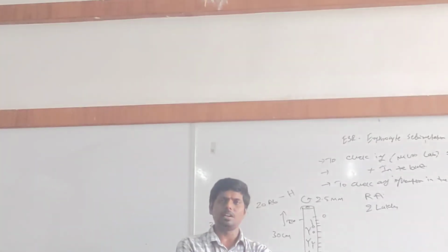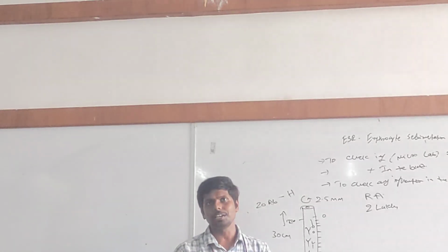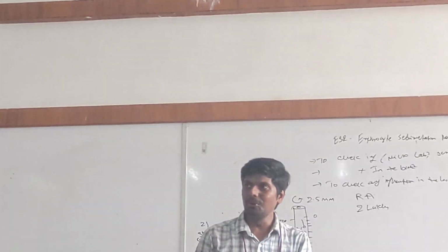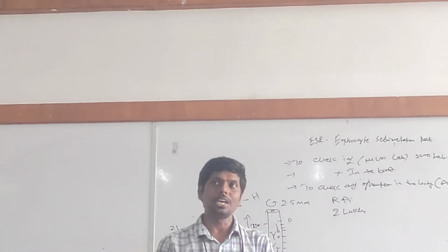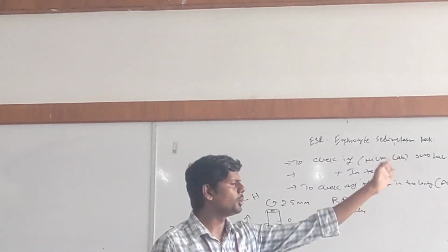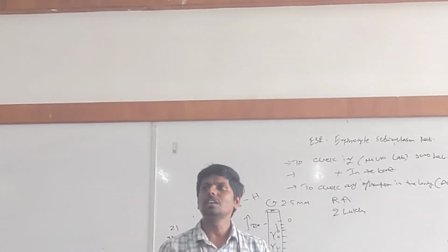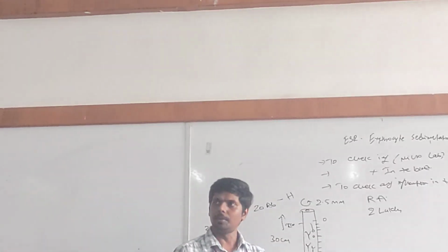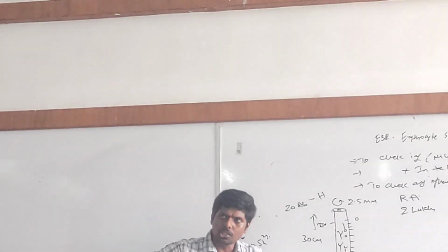I just need some amount of your blood. I will keep it in a vertical stand for 1 hour. After 1 hour, I will get the result. Only a 50 rupees report. If this test comes positive, then we will go for costly tests. If this test comes negative, we won't go for those screenings. We don't go for RA screening, which will cost 200 to 300. So that is the reason why this test still has importance. Is it clear? Any doubts so far?